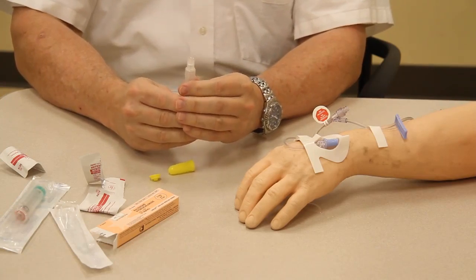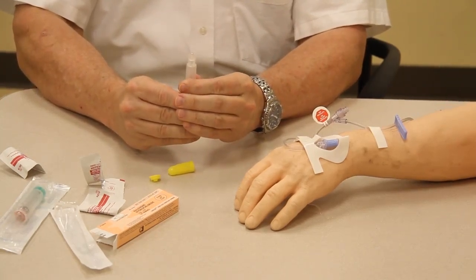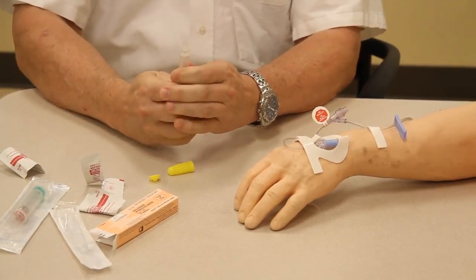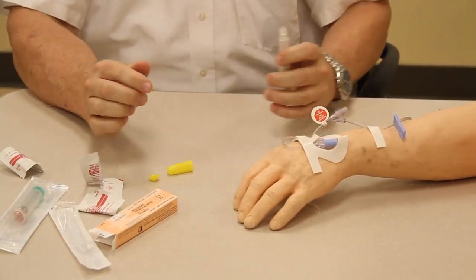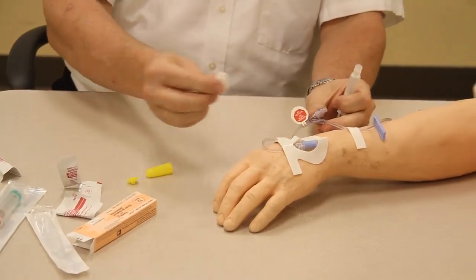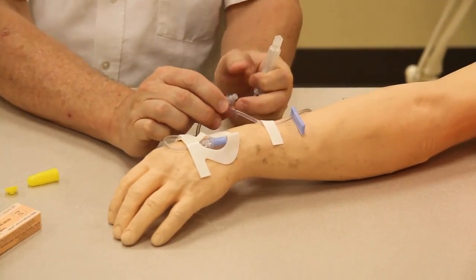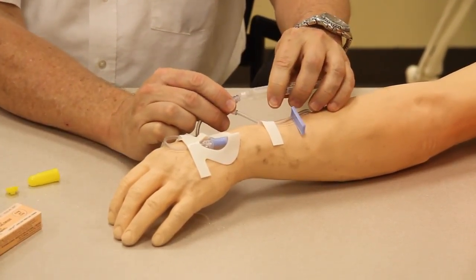Then I'm going to push what air there is in the medication out, like such.